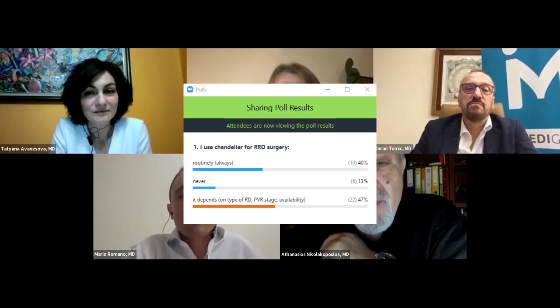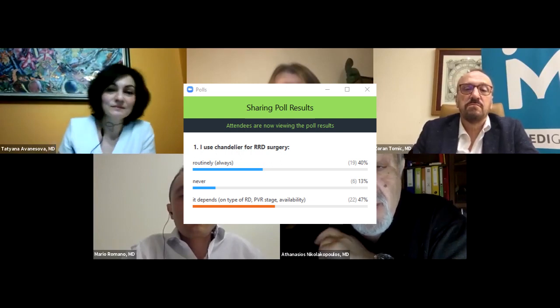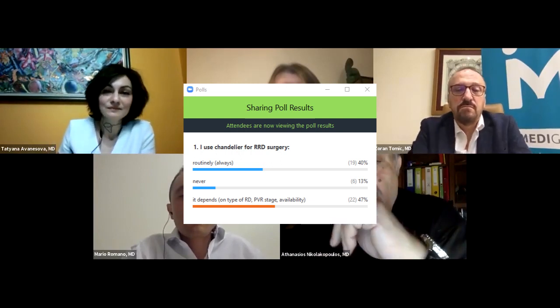Back 10 years from now, we did a presentation at the Euretina about the use of bimanual surgery. And bimanual surgery can be done only with a chandelier light. And then nobody was doing it. And now everybody, 40%, are using it routinely. And one nice thing about the chandelier lights is that they can be re-sterilized and they're not so expensive. And there are different types. So I think it's time for the chandelier light to go much more into practice than before.